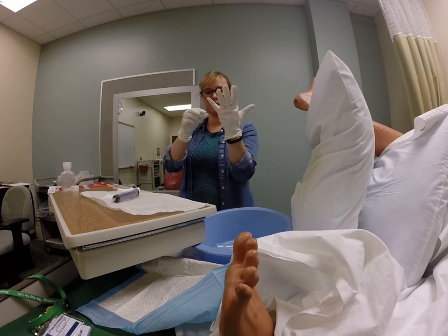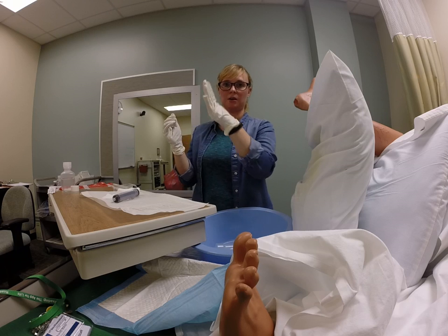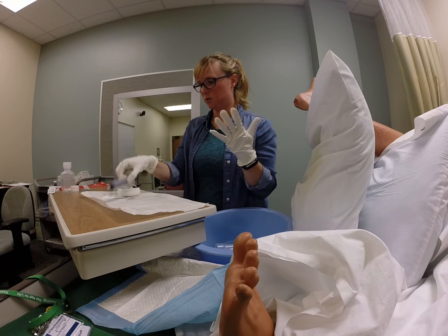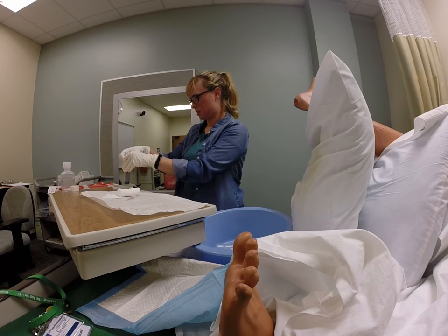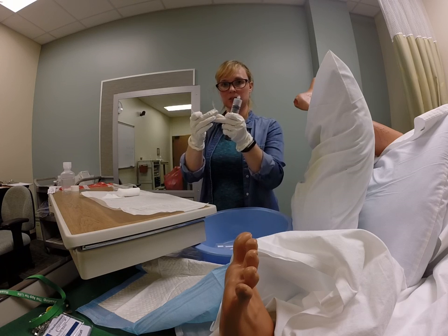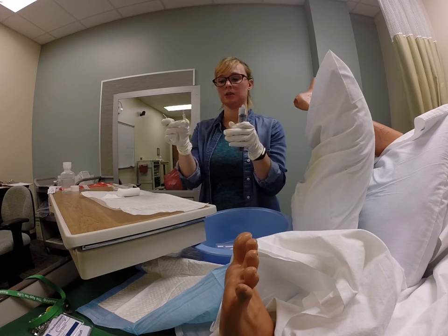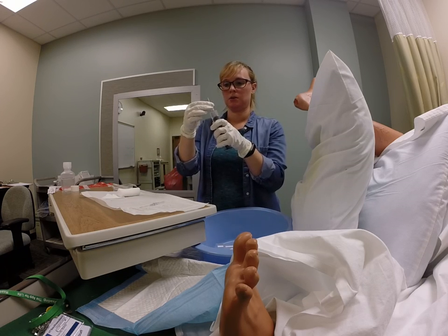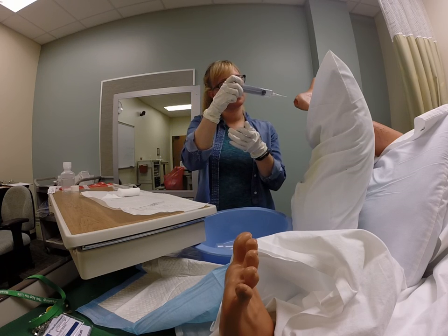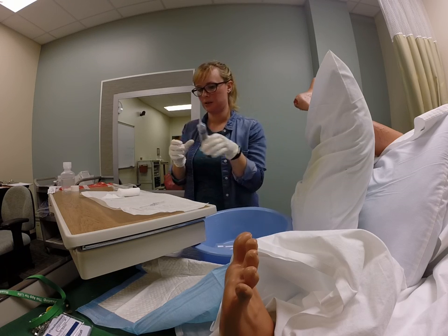Alright, so it didn't come down over my watch. Probably should have taken that off. But I'm not going to worry about it because I'm going to end up contaminating this hand if I try to pull it down. So again, first things first. Now this is a sharp, so do not throw it in the trash. You will be unsuccessful if you put this in the trash can. This needs to go in the sharps container. It's a big pet peeve. And then irrigate. You want with the flow of gravity, so the top to the bottom.